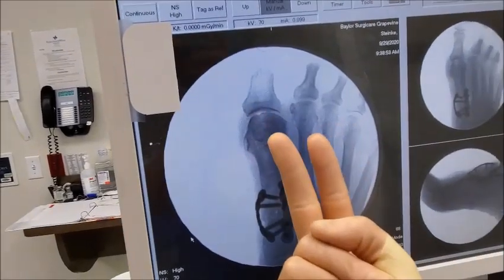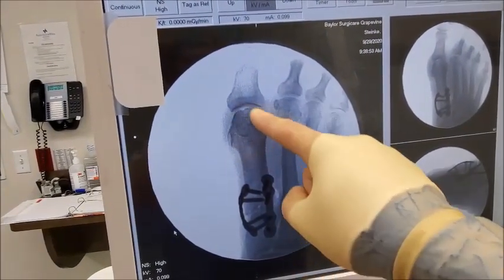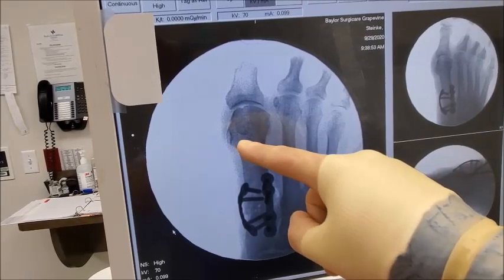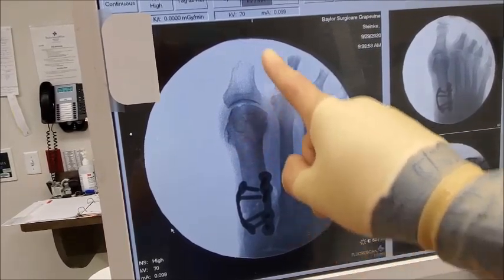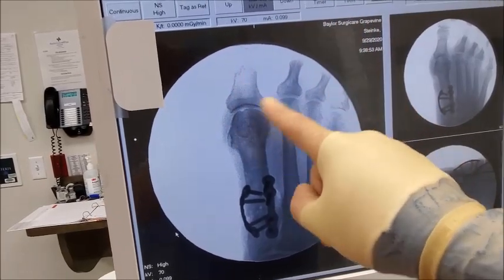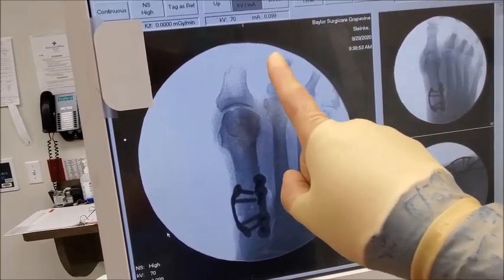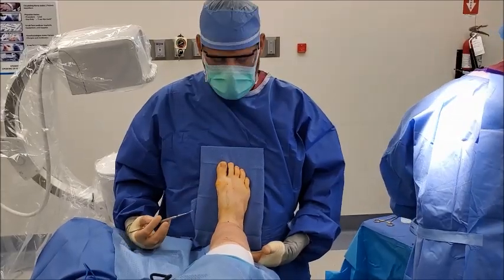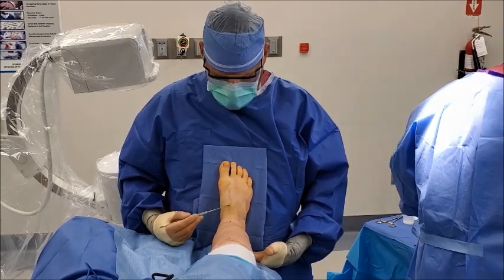Looking at our x-ray, you can see the angle between the two metatarsals has been reduced to parallel and the sesamoid bones are back underneath the joint. The last portion of the procedure is to take off the small bump on the side of her foot and potentially do a small procedure on the toe, since she has some chronic deviation that can affect alignment after surgery — we'll do everything needed to make that toe perfectly straight.